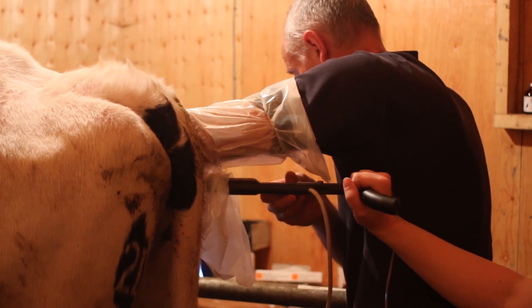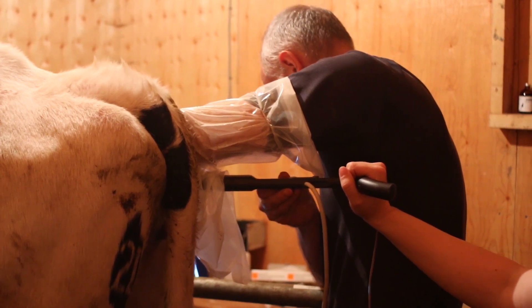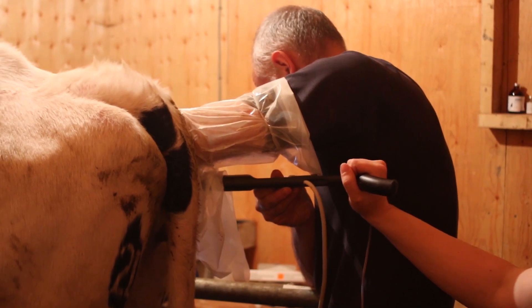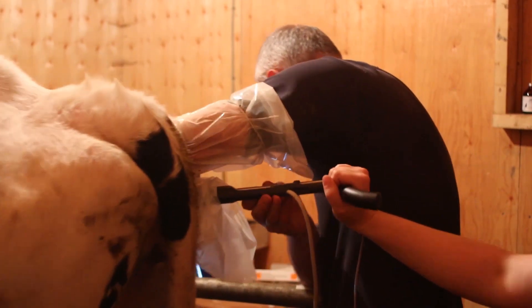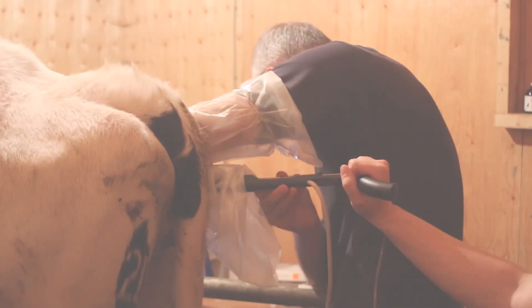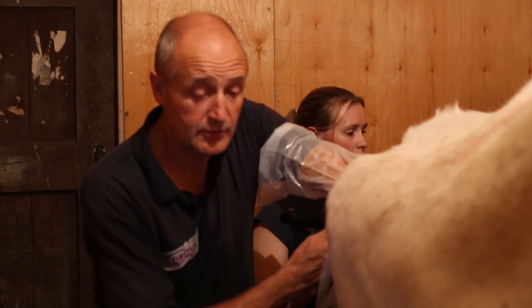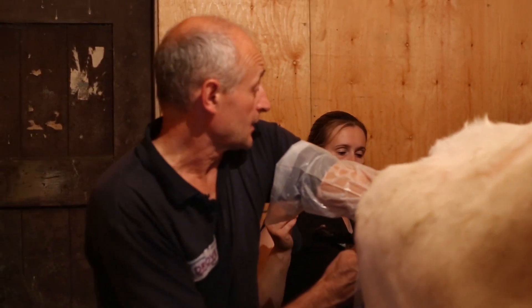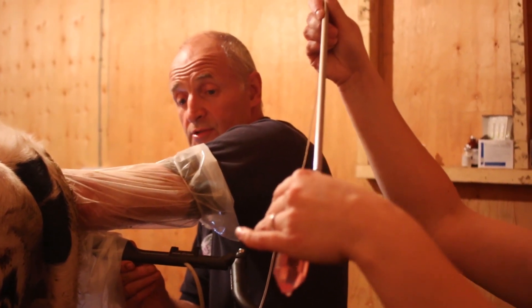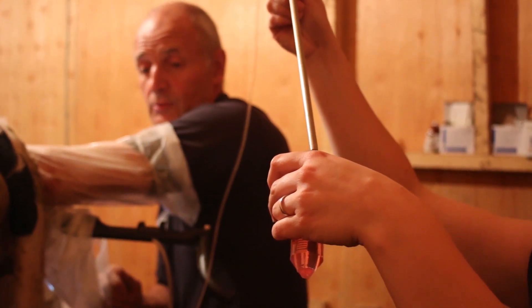Okay, pedal. I can hear the little noise going there which reassures me the vacuum is working. After puncturing a few follicles, we pull the needle guide out and flush through the collection medium, which clears the tube, stops any blood clotting in it, and you can see the fluid passing down the tube into the water bath.